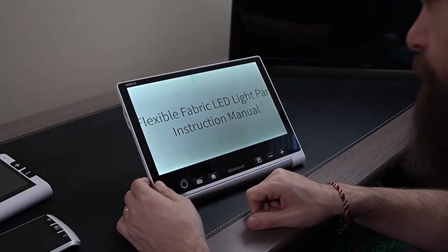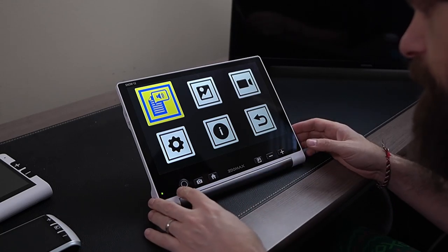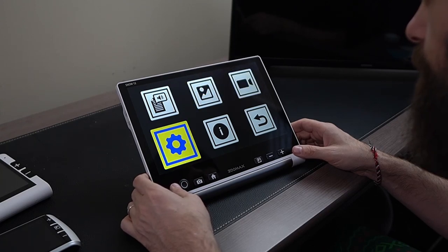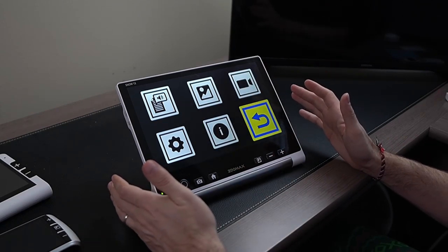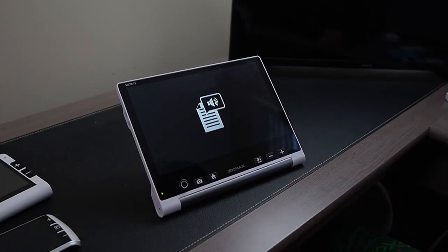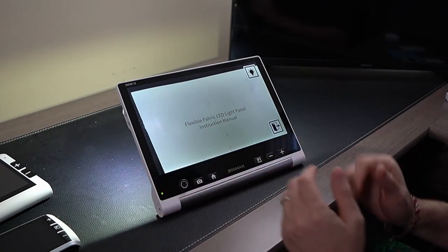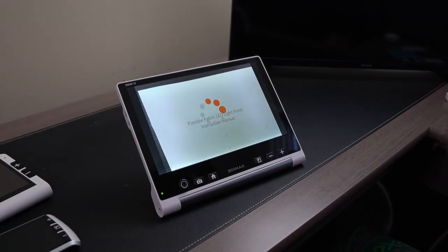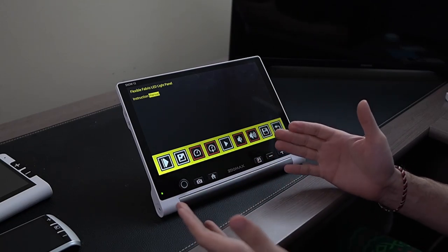If we click the home button, this takes us into our main menu and we have some options. We can use the joystick to move around. This is a touchscreen — if I tap on one of these icons it will automatically launch that. So if I touch the text-to-speech icon, it automatically launches that function. I'll turn my light back on — there's a little icon up there that brightens things up. If I click the camera button, it takes a picture and then processes it pretty quickly and reads it out loud.